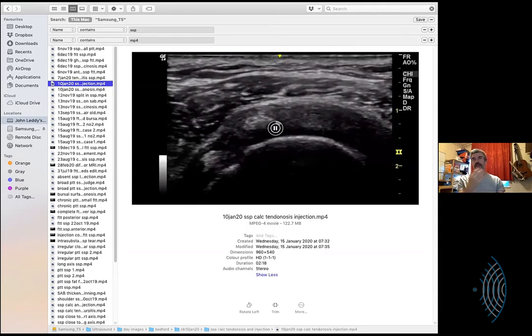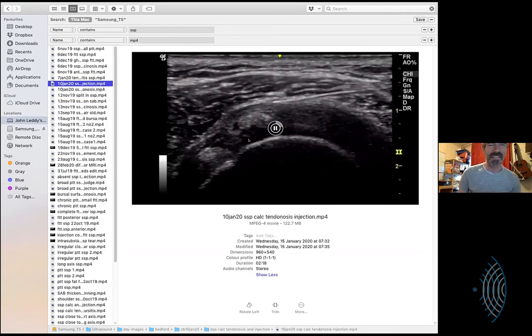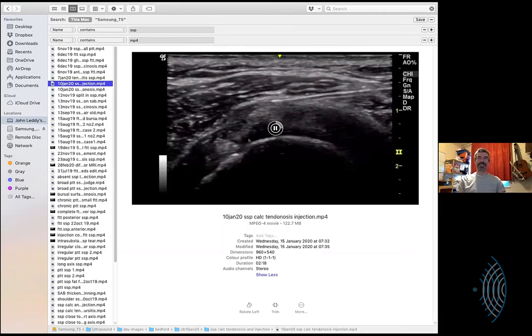Okay, so this is an interval view, and I'm seeing the long head on the left. It isn't actually the interval view. This is my short axis view of the supraspinatus. Interval would need subscap. Yeah, what I call the three tendon view.